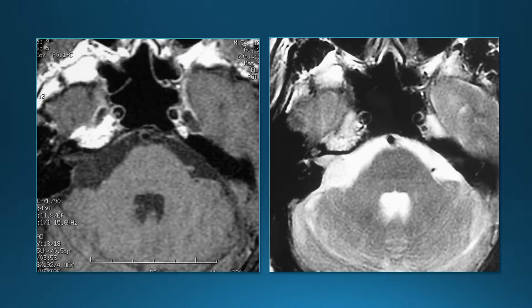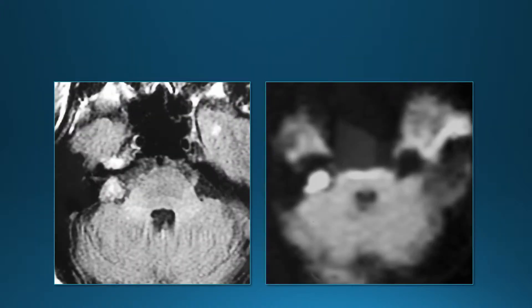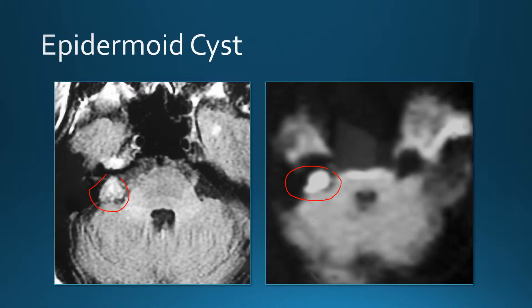Another lesion in the cerebellopontine angle on the right — dark on T1, bright on T2 — looks very similar to the arachnoid cyst we just saw. Except here on FLAIR the lesion is bright, and on diffusion it's also bright. So instead of an arachnoid cyst, we're dealing with an epidermoid cyst.